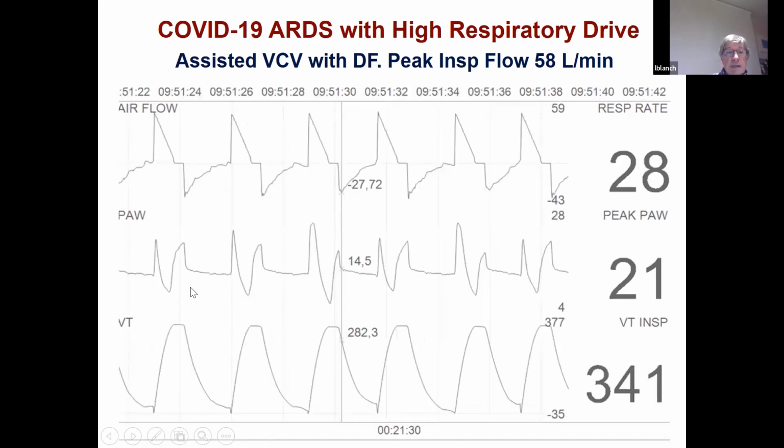This is another example. In that case, caused, as you will see here, and I'll let you think for a while, by reverse triggering. There is no inspiratory effort by the patient here. This is a time cycled machine that immediately triggers an inspiratory effort of the patient, but not in this breath. It occurs only in these 3 breaths, but in that breath, the patient triggers the ventilator. That's why the pressurization is not similar as here, because the patient is increasing the work of breathing from the beginning. It's triggering the respiration and increases the work of breathing. Here it is done just after 100 or maybe a little bit more milliseconds of the time cycled breath initiation.